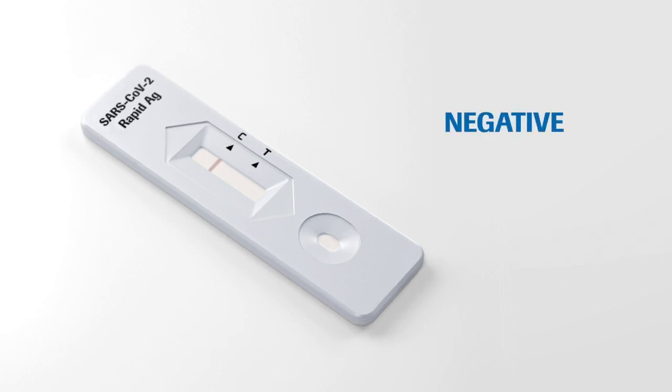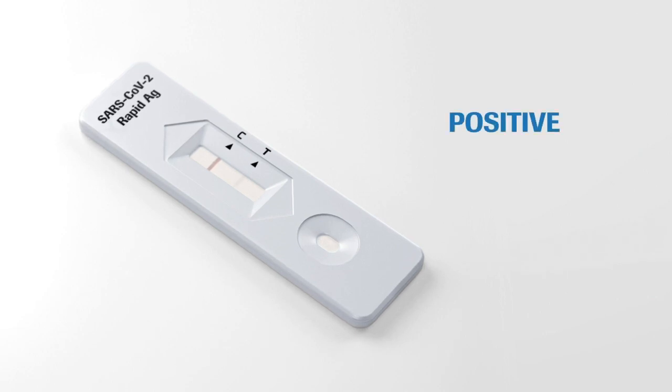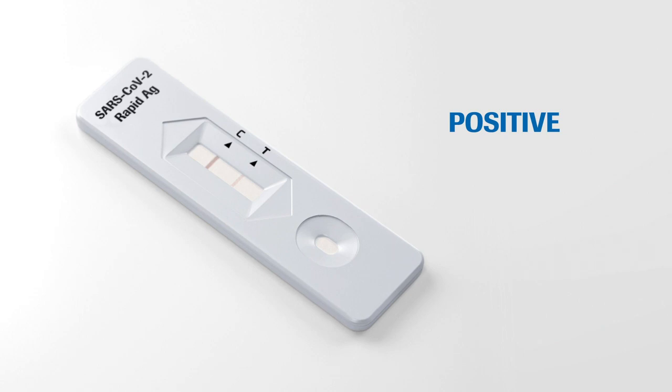In the case of a negative result, only this line appears. In case of a positive result, a colored line appears in the lower section of the result window. This is the test line T. Even if the test line is very faint or not uniform, the test result should be interpreted as a positive result.